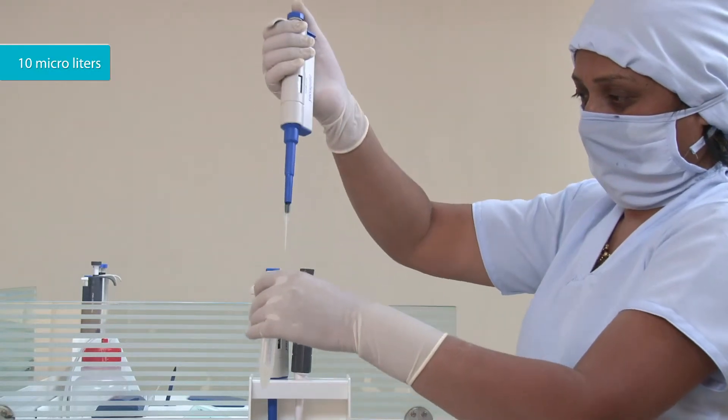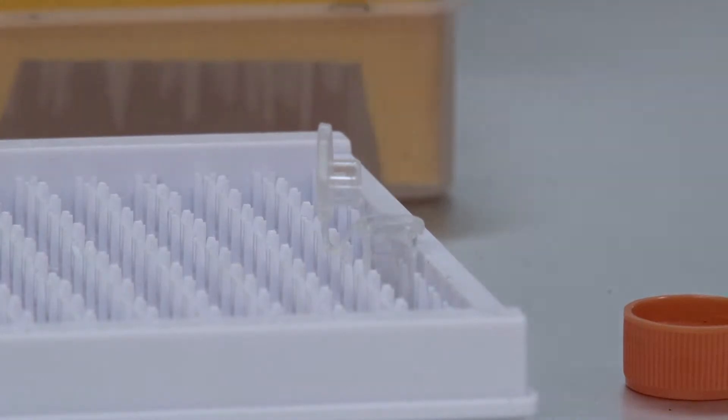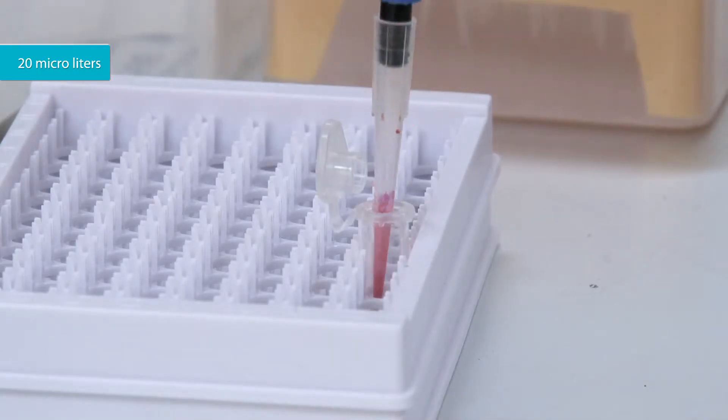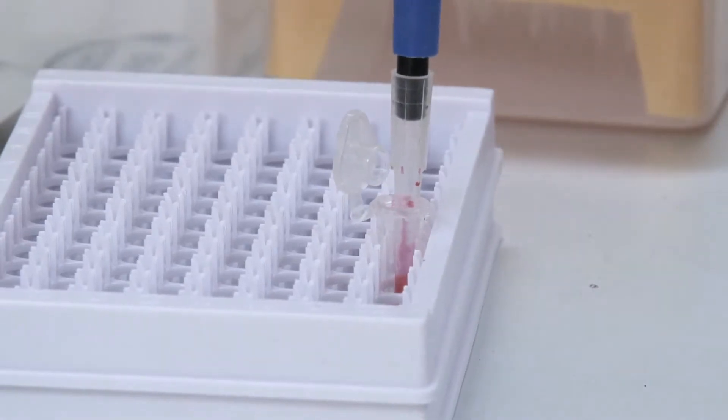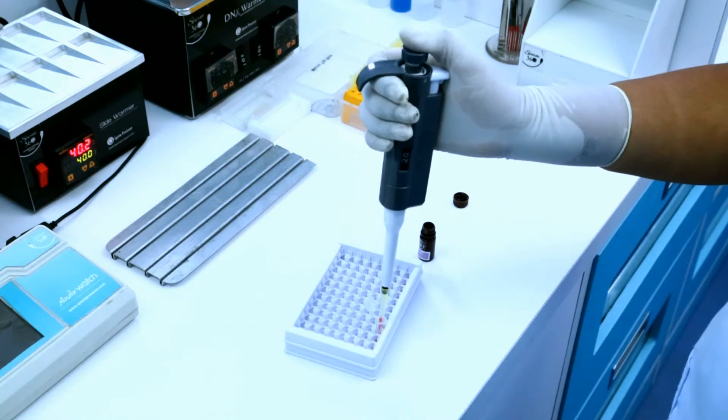Put 10 microliters of liquefied semen into the microtube. Add 20 microliters of eosin dye to the microtube. Mix the dye and semen using a pipette tip.